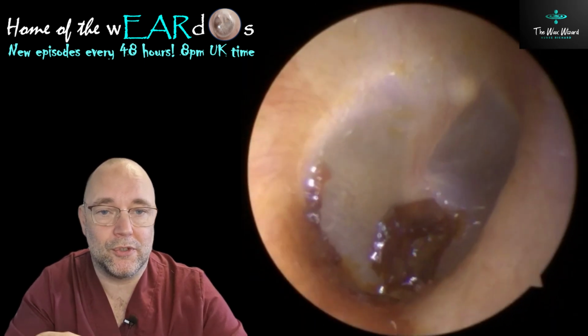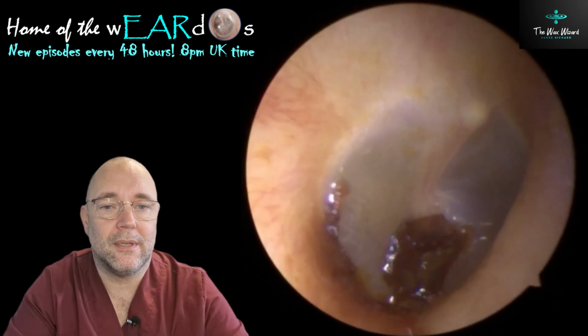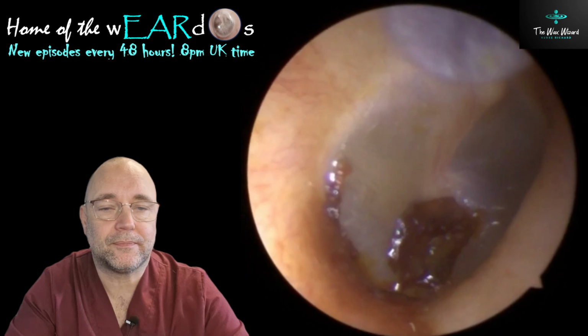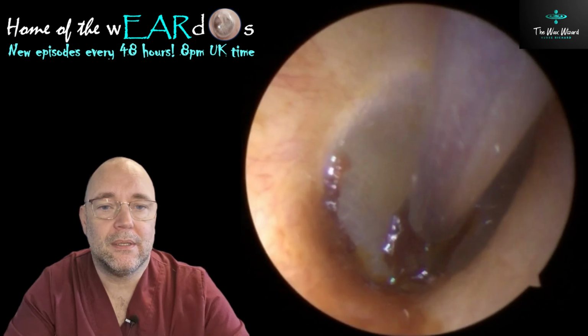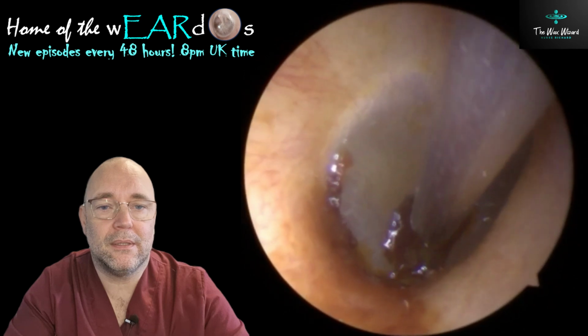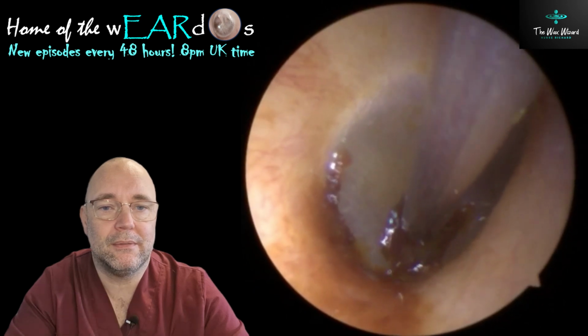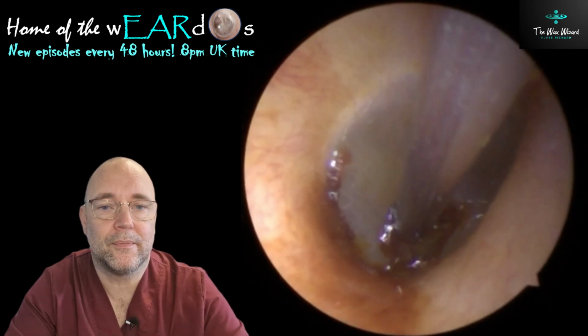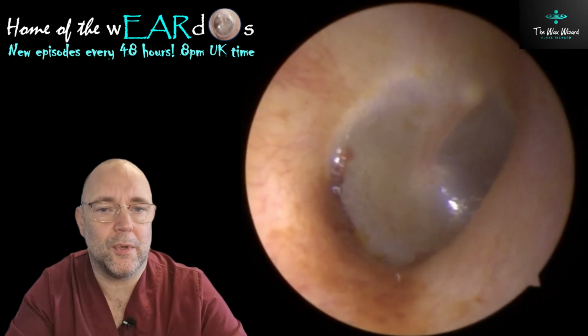But it's that bit on the drum. You'll just see it slightly flex a little bit because it is a little bit stuck on it. So let's go down really, really careful. And you just kind of dab it, move away until you get close enough and it comes. There you go.